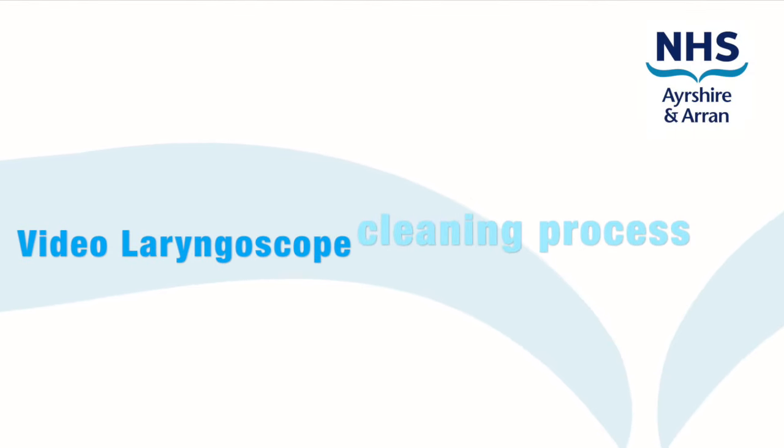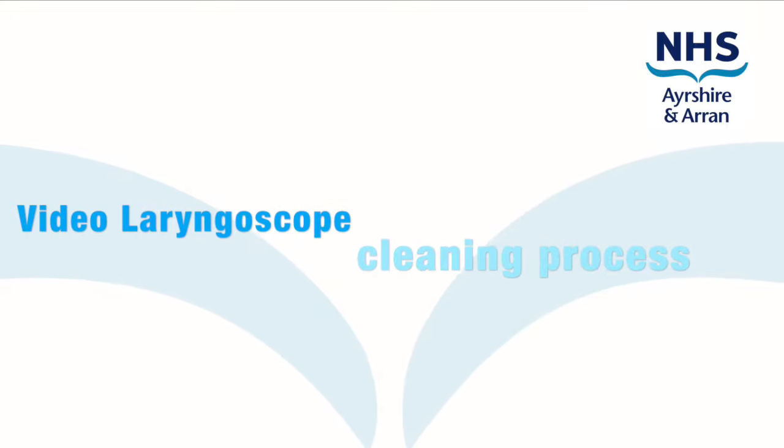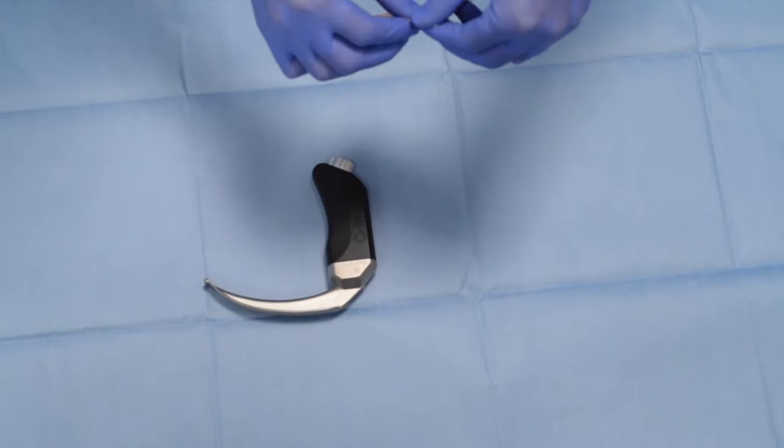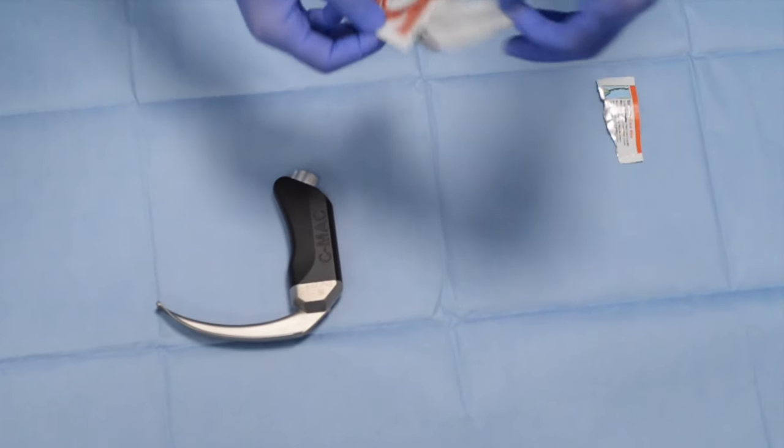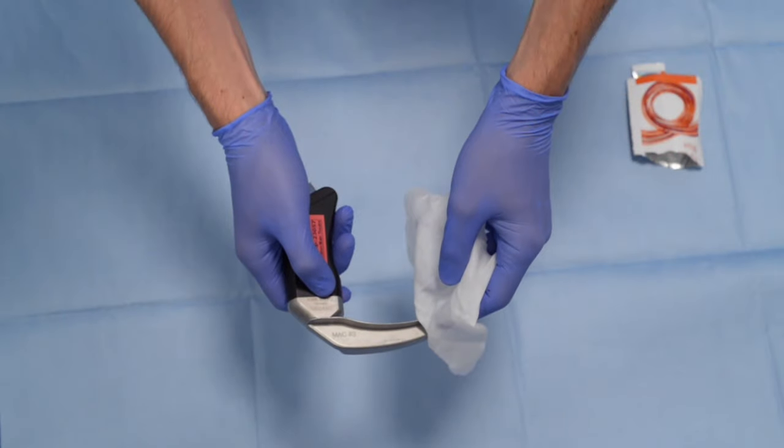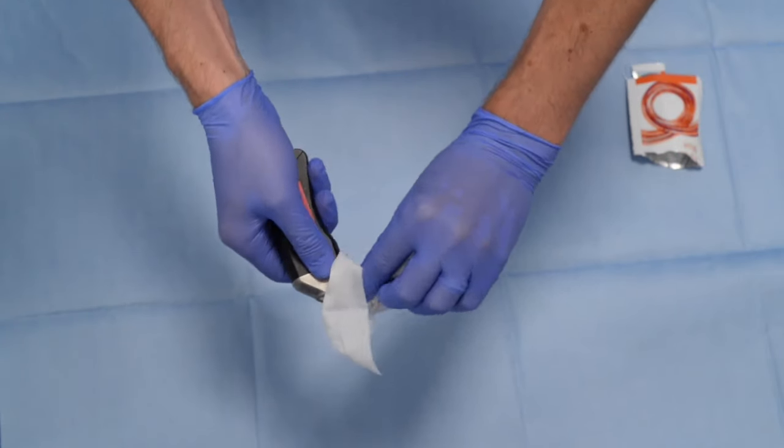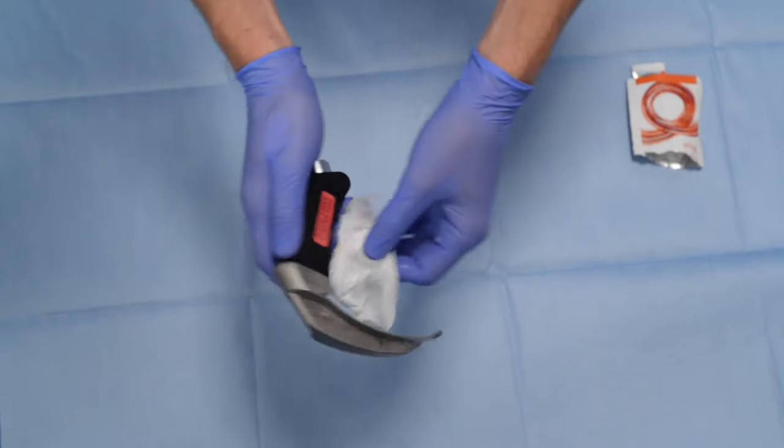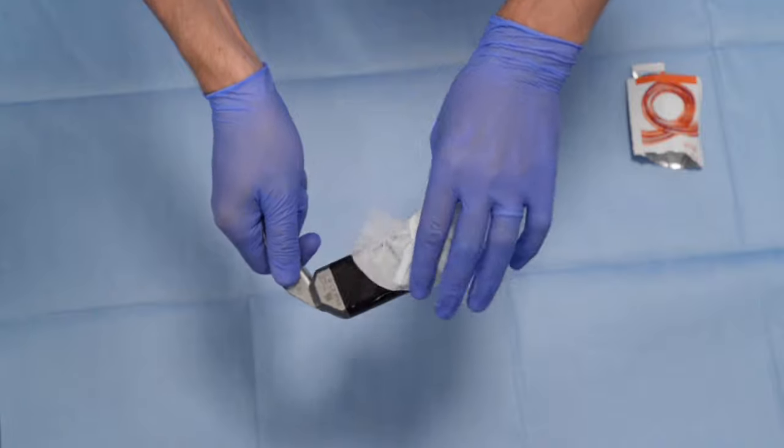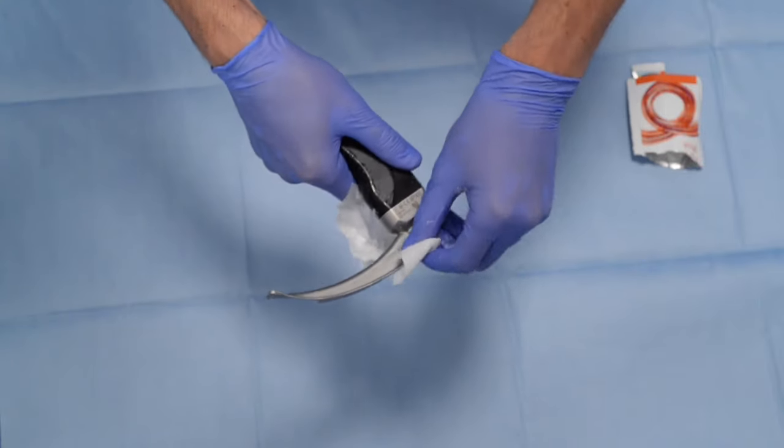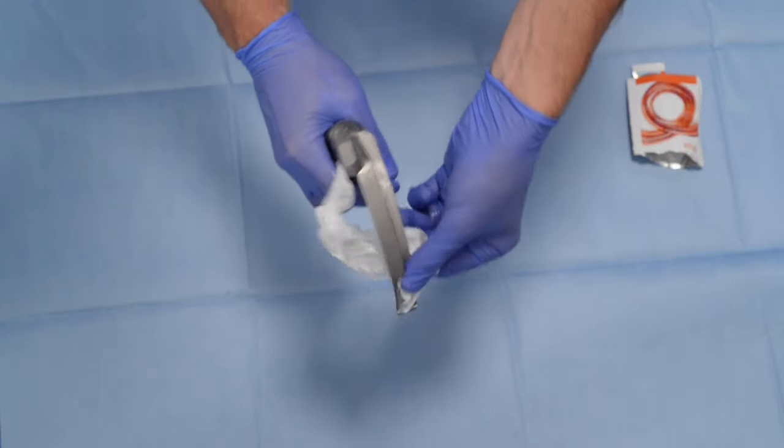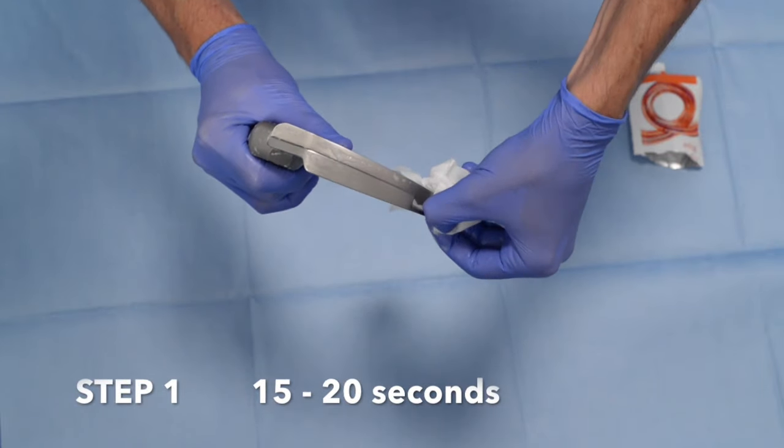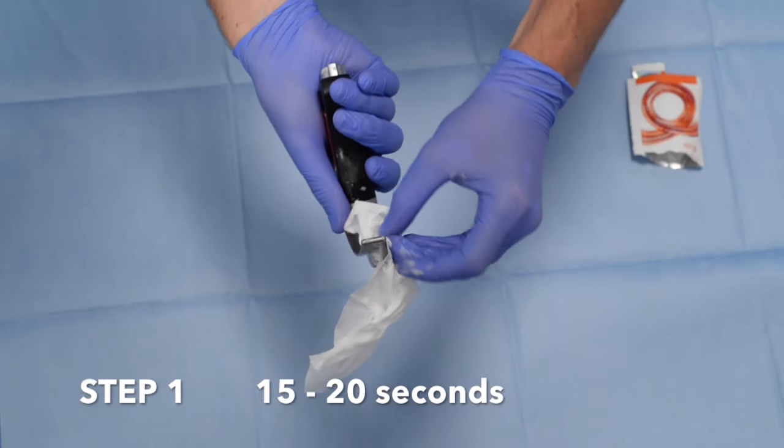To start the cleaning process, remove any obvious contamination with running water. Then you're ready for wipe number 1. This is a pre-clean. Make sure all the blade is wiped down and the handle. Take particular care around the small clips. Do this for about 15 to 20 seconds.